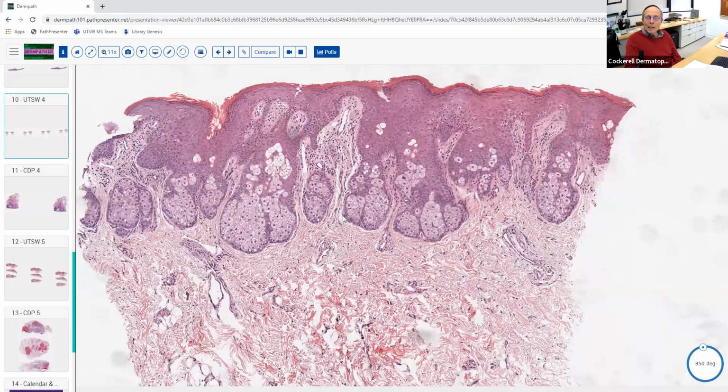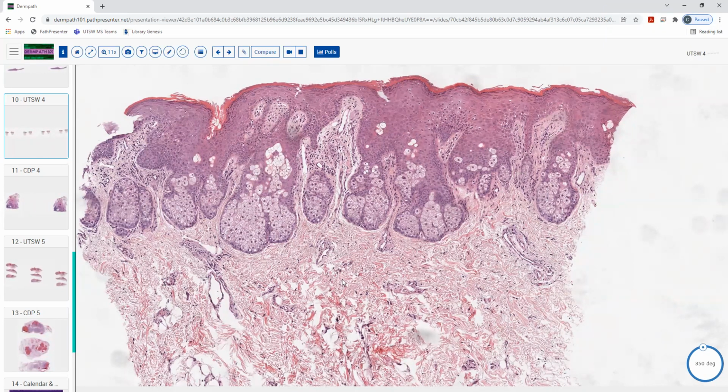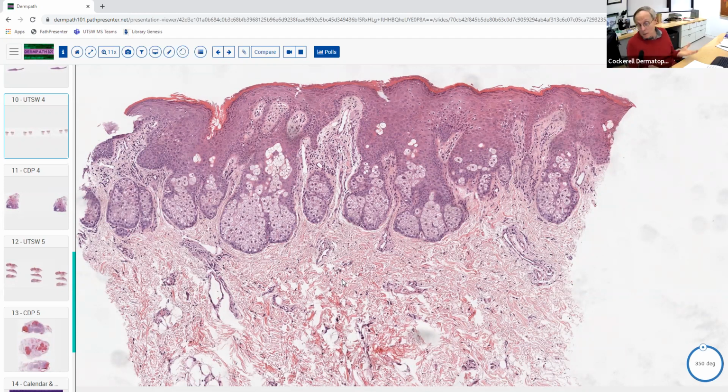So what's your differential diagnosis when you see a lot of sebaceous glands per unit area like this? Well, if I'm thinking neoplasm, you know, it could be neoplastic or maybe hamartomatous. Right. Okay. And so is that it?